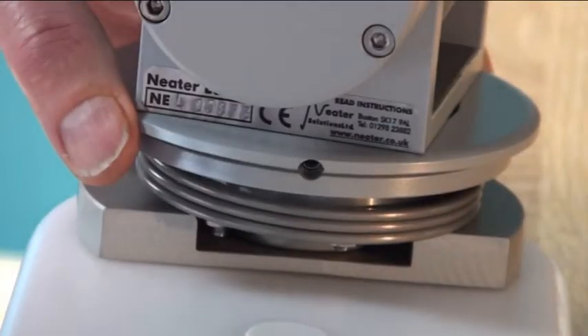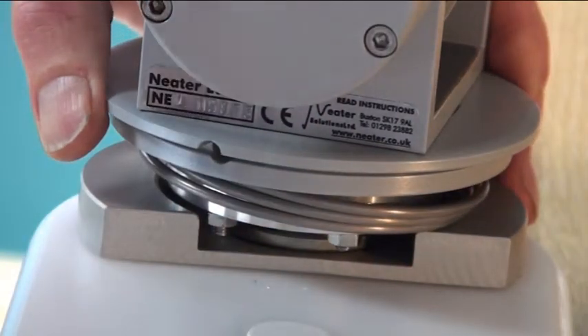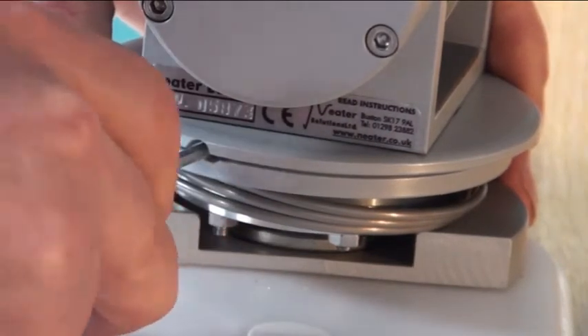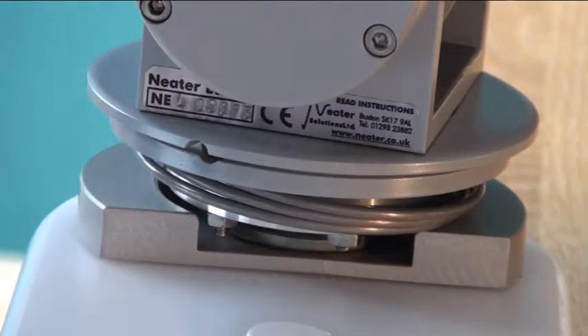If you want more tension on the spring to make the arm go faster, turn this clockwise a little bit before re-tightening if it's a right-handed unit, anti-clockwise if it's left-handed, and then readjust the stops.